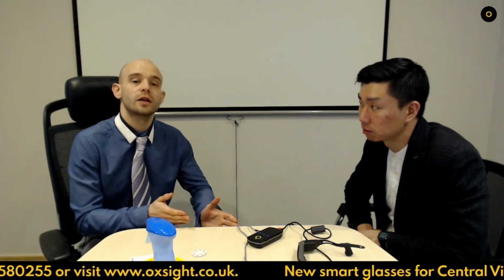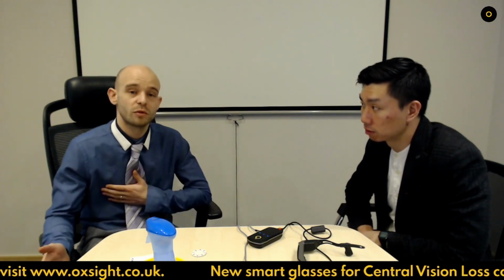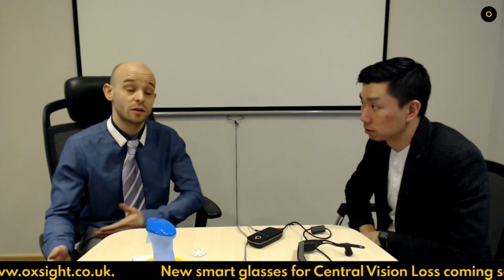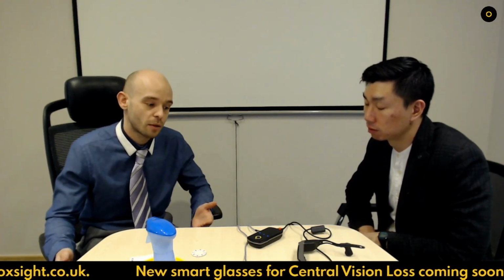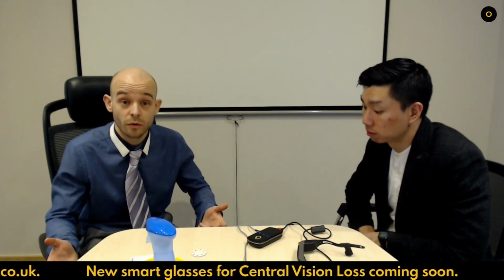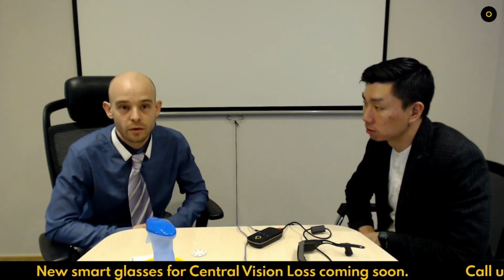We've also got things like different cases that come with the glasses. So you've got a hard case that you can use in case you want to put it in a handbag or a satchel. We've actually got its own satchel case. Now, generally speaking, when I'm out and about on the road, I use the satchel case mainly because I can fit all my accessories in there, my external camera, my glasses, the handsets. I can even fit my phone in there if I want to. It just makes life a bit easier to be able to have everything in one area.